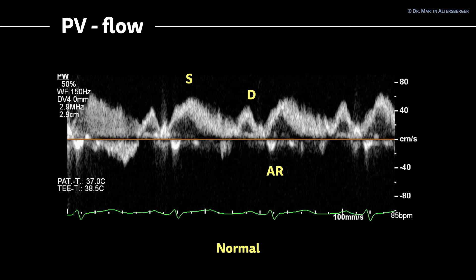You have a normal systolic flow and a normal diastolic flow — the diastolic flow is a little bit smaller than the systolic flow. This was a TEE study, not a TTE signal, so in TEE you can very often nicely delineate those signals.